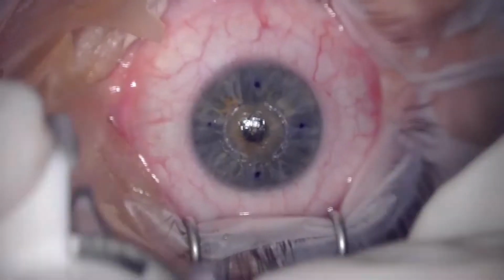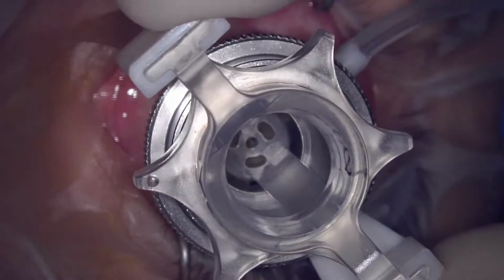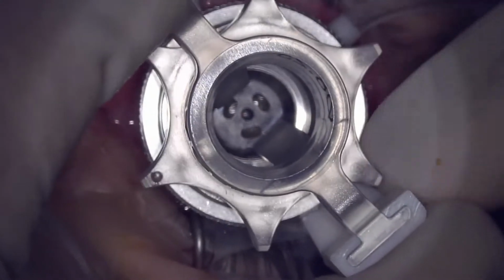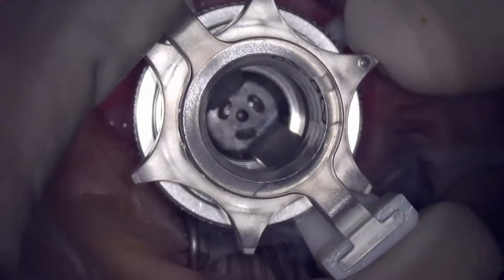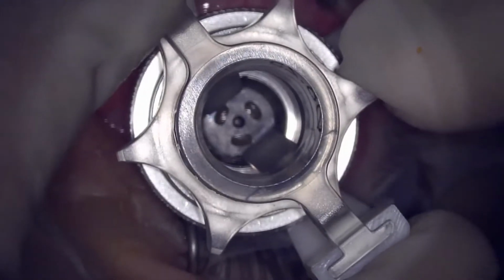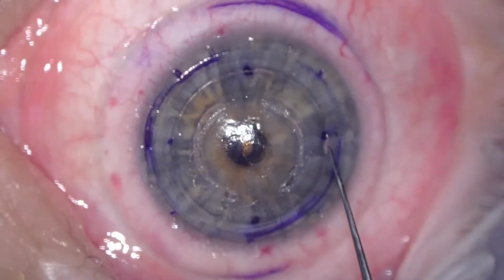Here you can see on the adjustable trephine, I've marked the vertical and horizontal meridians on the little notches. I've adjusted the trephine to give me a depth of 400 microns, and now I'm applying suction, and I've achieved suction successfully, and now I'm just trephining down to the fixed depth. I find this trephine really easy to use. An adjustable trephine is also almost essential for me to use for these cases, as it removes another complicating factor in terms of knowing how deep to trephine.